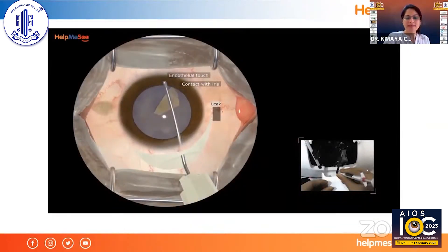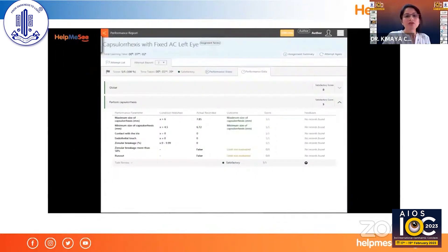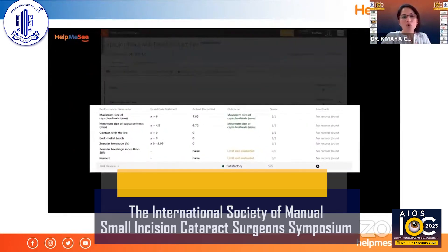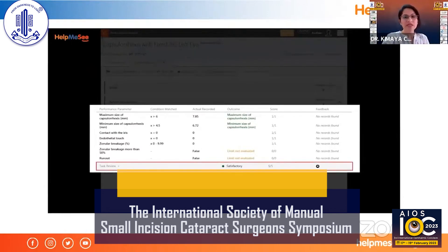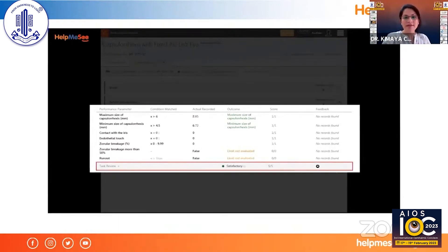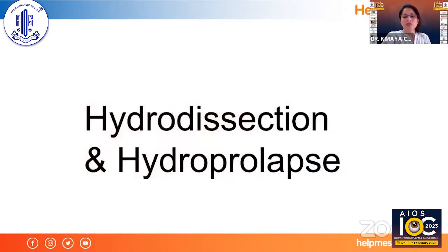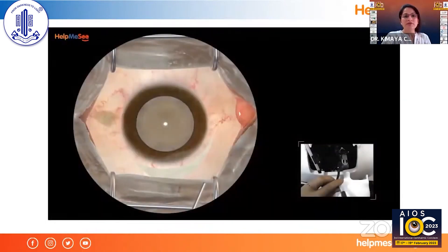These are the performance parameters you can see, with a scoring system. How many times you made a particular mistake, how many mistakes in total — everything is recorded, making it easy to identify where to improve.